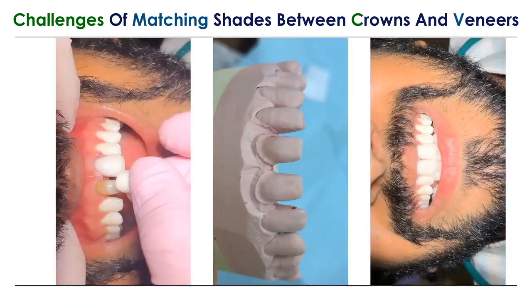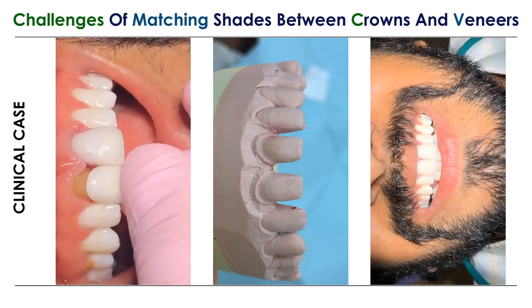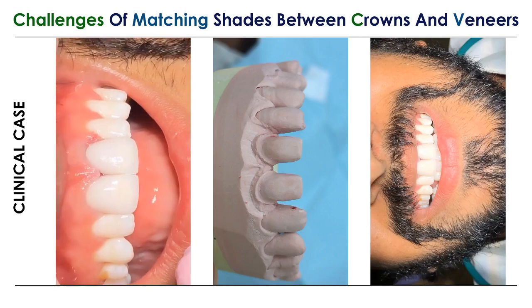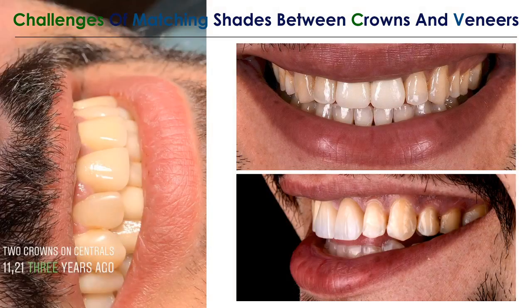It's very important to do a try-in, to put resin and try in the color, and to take photography before doing the final cementation for the patient. It's your responsibility to let your patient be happy with his smile.